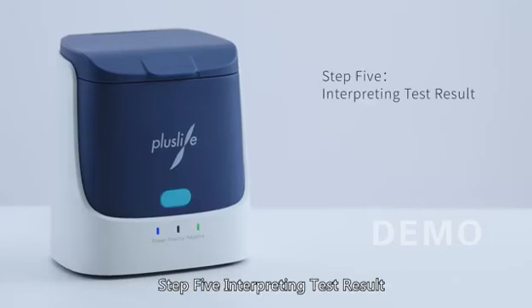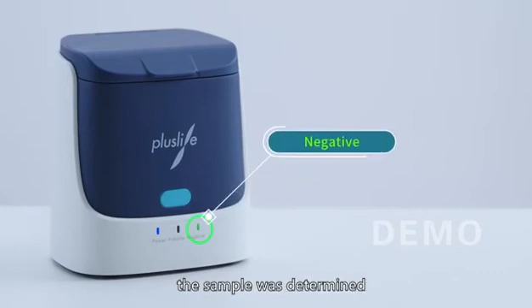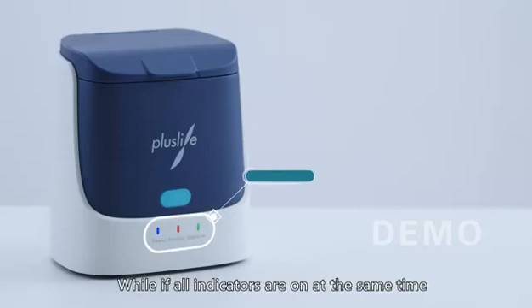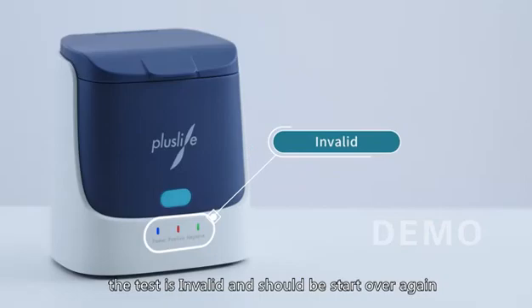Step 5 - Interpreting Test Results: The test result will be displayed by the indicators after 15 to 35 minutes. When the negative indicator lights on, the sample is determined to be SARS-CoV-2 negative. When the positive indicator lights on, the sample is SARS-CoV-2 positive. If all indicators light on at the same time, the test is invalid and should be started over.